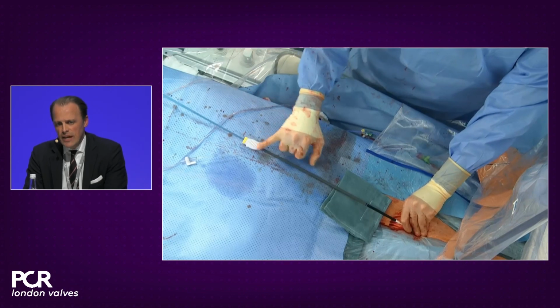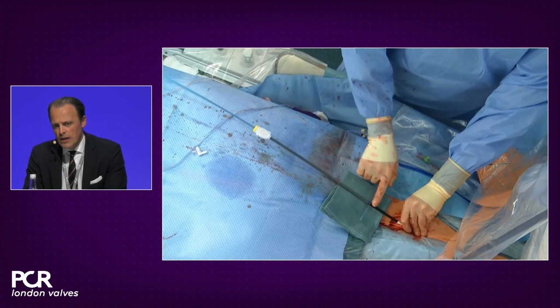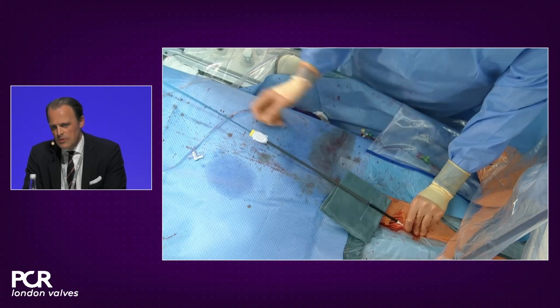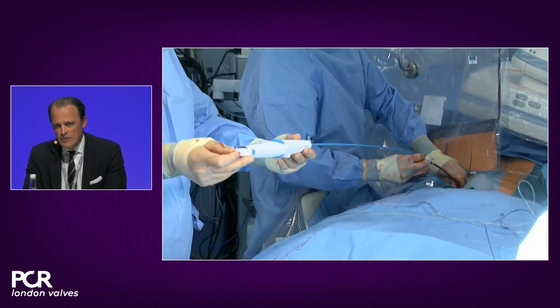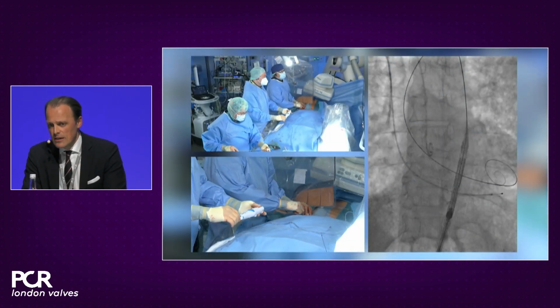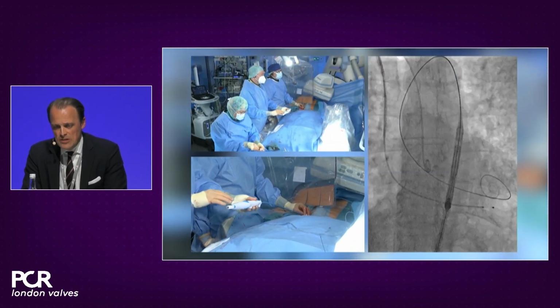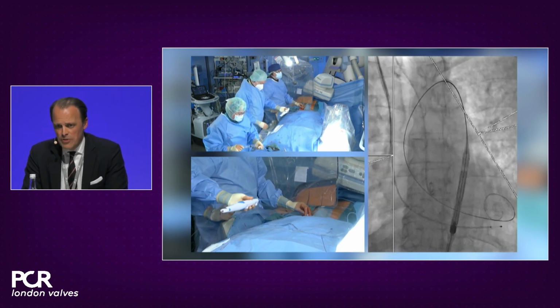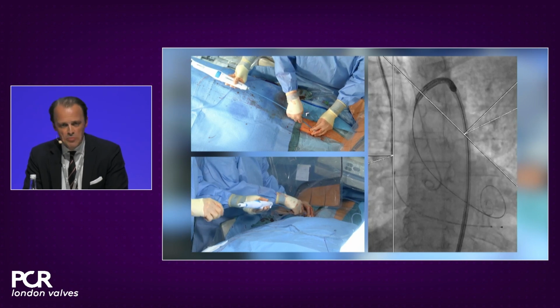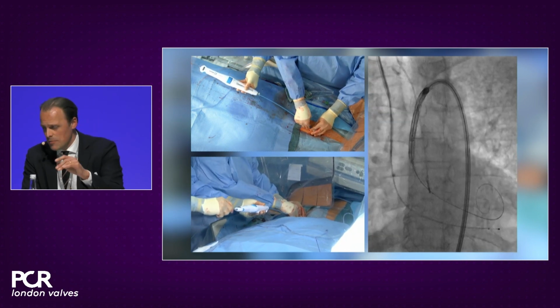This is the Flex Nav. You see the inline sheath right here. It's a very nice, smooth transition zone to the actual implant catheter with a nicely tapered tip, and it slides in easily, in my experience, as Danny and others have said, even across tortuous anatomies, even across small caliber vessels. Also, it travels very nicely across the arch due to the flexibility of the system, even the capsule housing the valve.